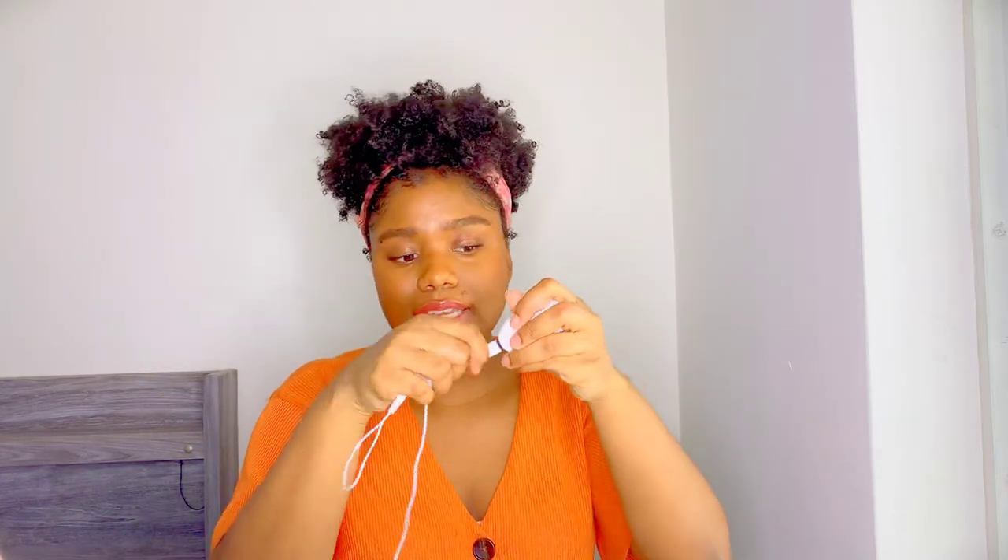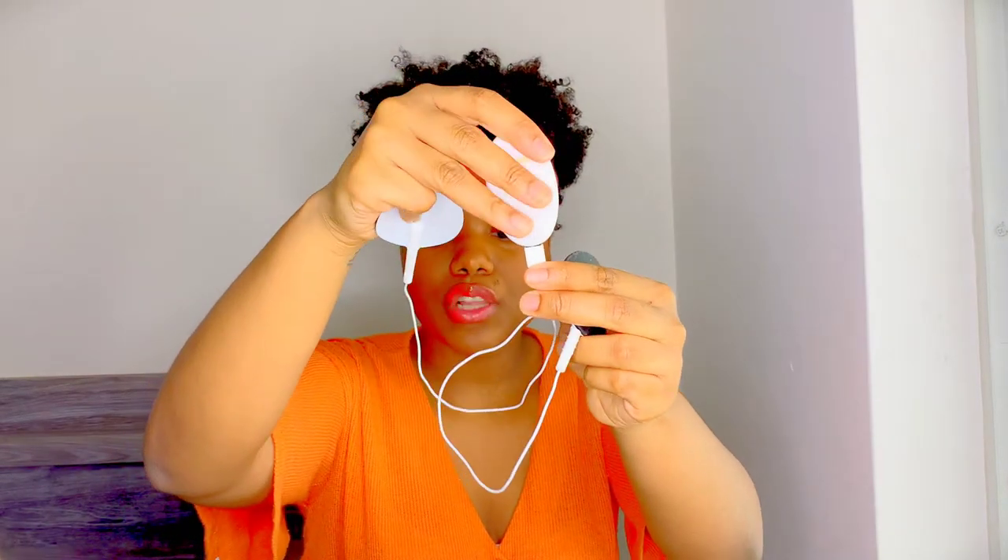Basically how the product works: you connect the pads with this part of the device, then connect it here. Mine came charged. Then you press the power button and a light comes on — I believe it's a white light. You can increase the strength by pressing up and decrease it by pressing down. Then you place this where you're feeling pain.